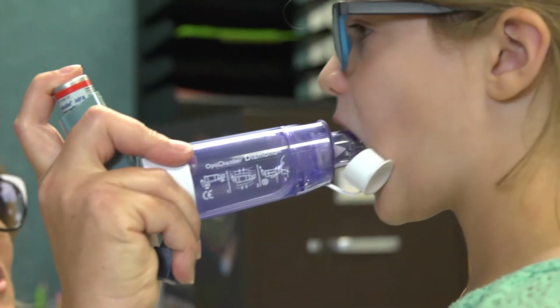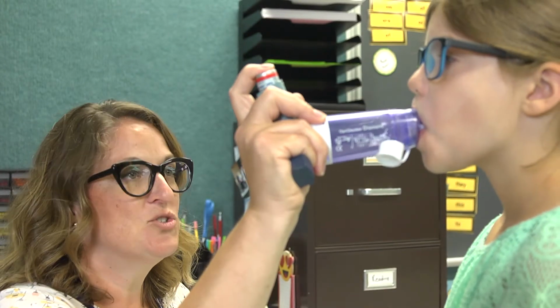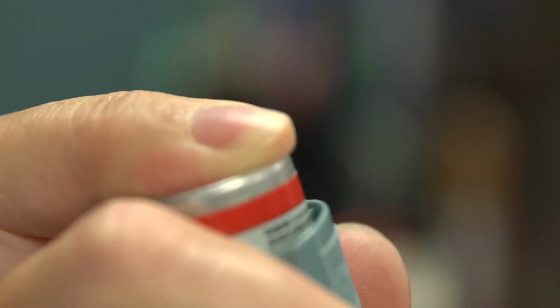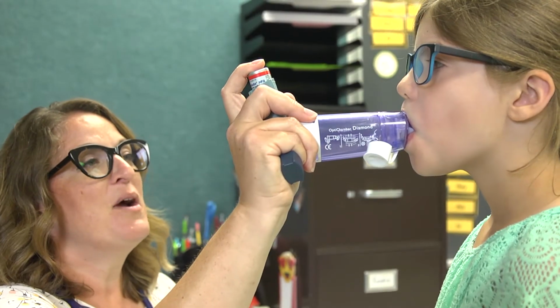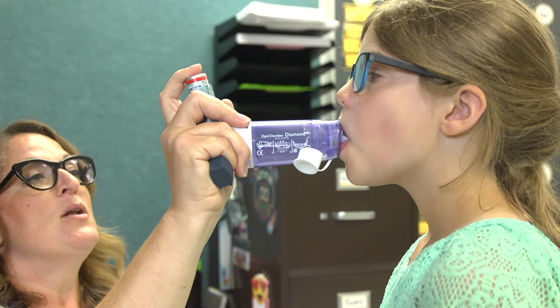Have the student place the spacer between their teeth and place their lips around it. Follow the individual spacer instructions. Press down on the top of the inhaler once. Instruct the student to breathe in very slowly until they have taken a full breath. If you hear a whistle sound, instruct the student to breathe slower.